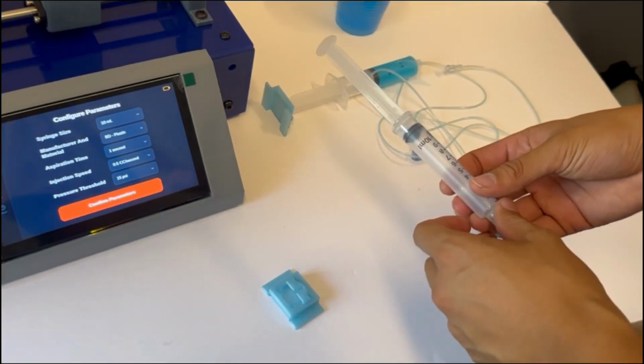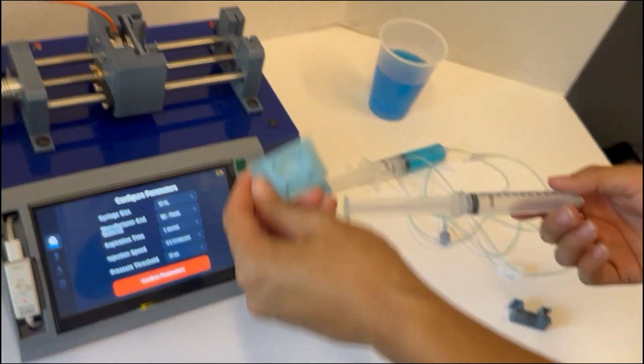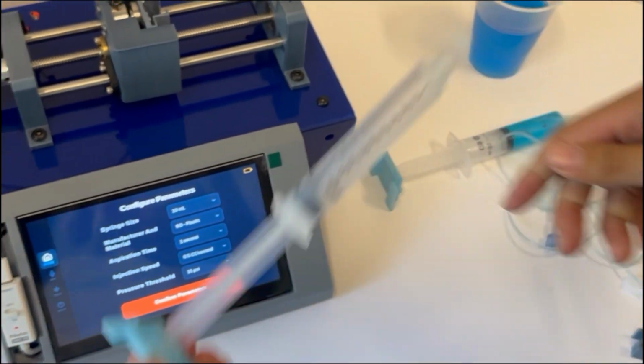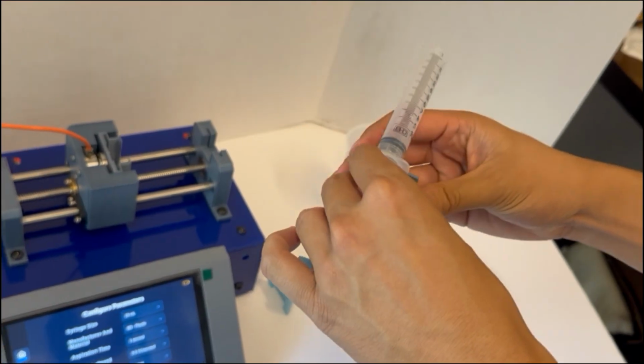So now we're going to demonstrate the procedure with the 10 milliliter syringe. It's almost the same setup. You just have to find the specific backing for the 10 milliliter syringe. It should have this little flap here. You line that up with this back and snap it in the same way. You should hear a click. And then the difference here is that this one also comes with an extra attachment.